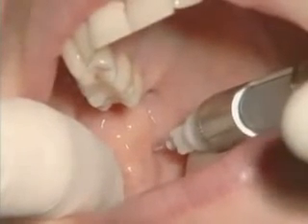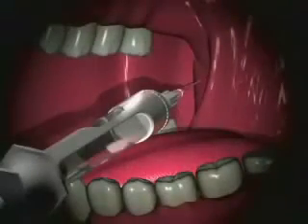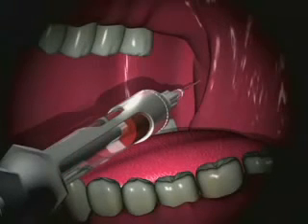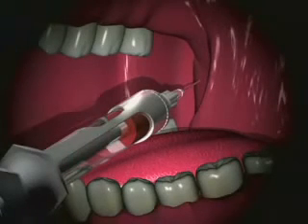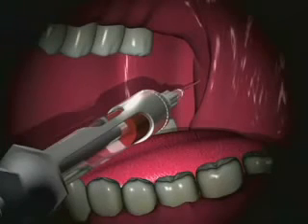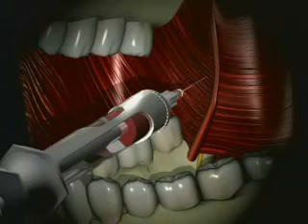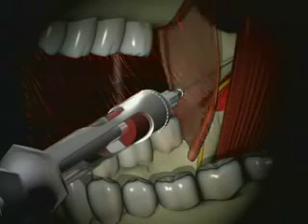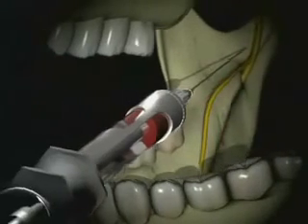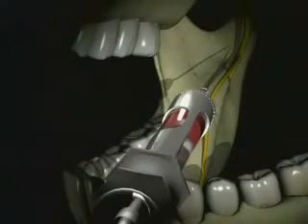Once bone is hit, you withdraw slightly, aspirate, and slowly begin to inject a full cartridge of local anesthetic — unless you are following with a buccal nerve block, in which case you should inject three-quarters of the cartridge. At this point the needle is passing through mucosa, a thin portion of buccinator muscle, loose connective tissue, and adipose tissue. It lies lateral to the medial pterygoid muscle and the sphenomandibular ligament, and medial to the ramus of the mandible.